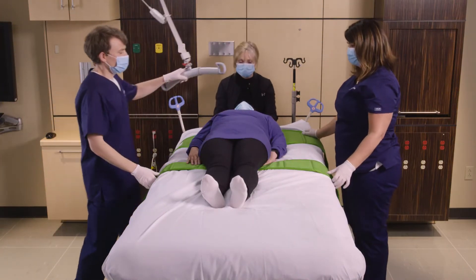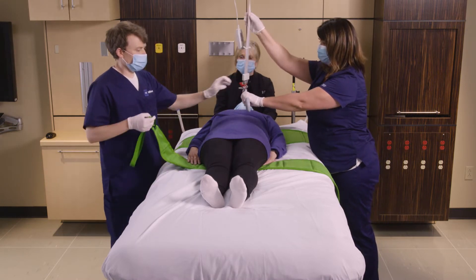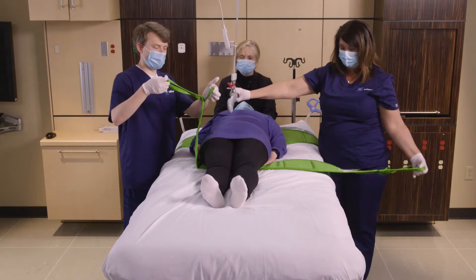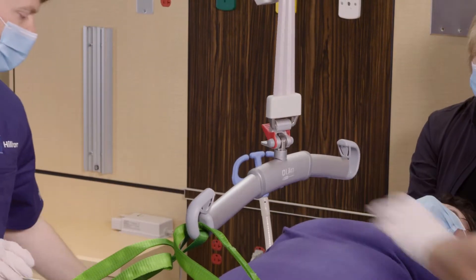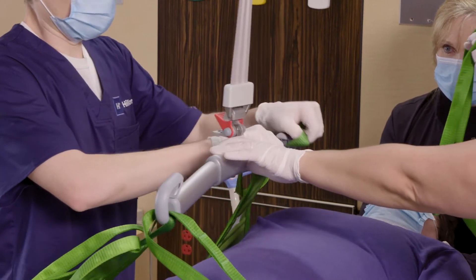When we attach the straps to the lift, we're going to attach the short end to the short loop and the long end to the long loop. This is going to create a further difference in length between the two sides.